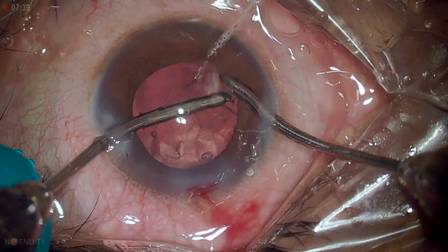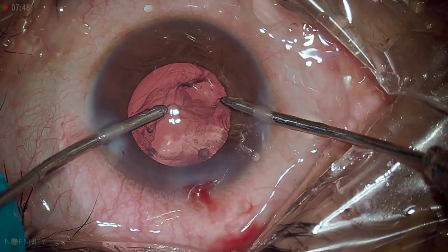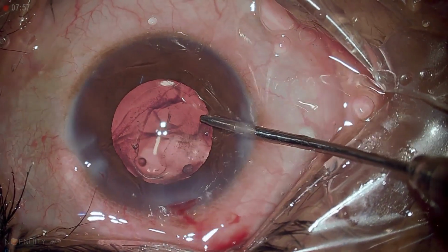So once the cortical aspiration is done, we proceed to put the IOL.